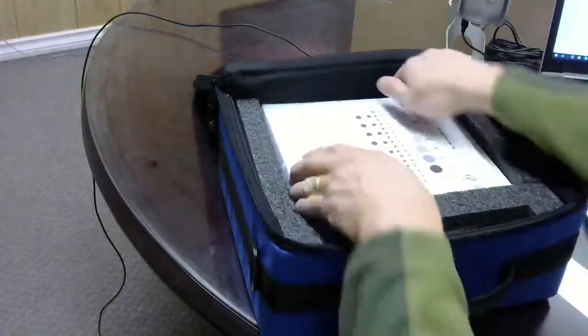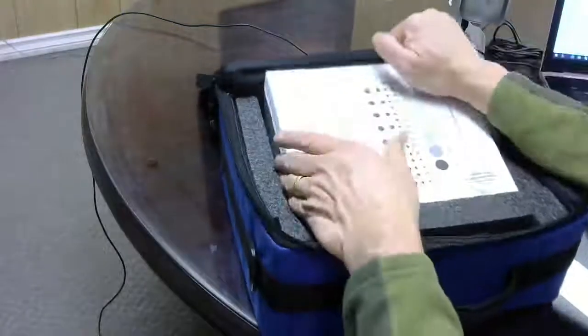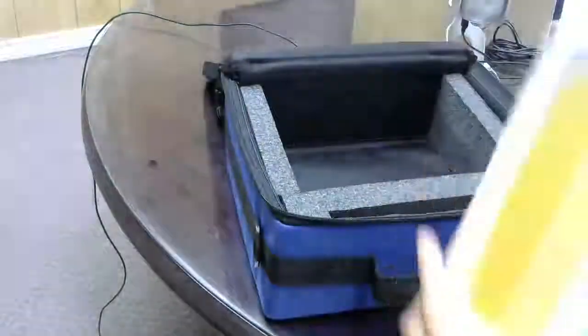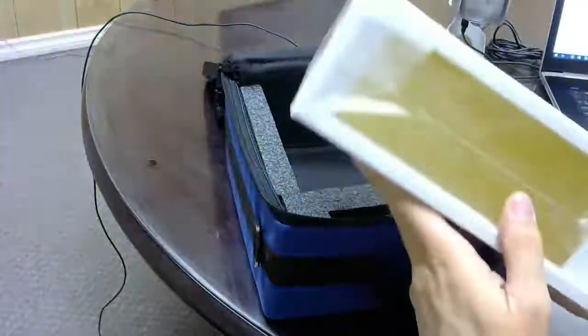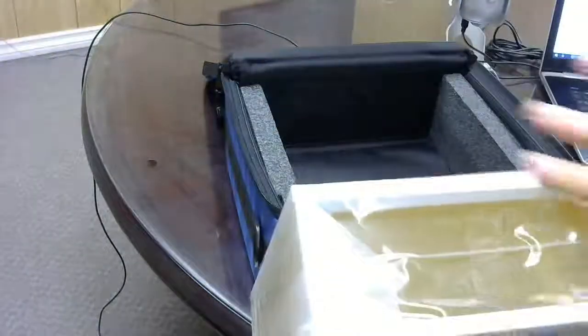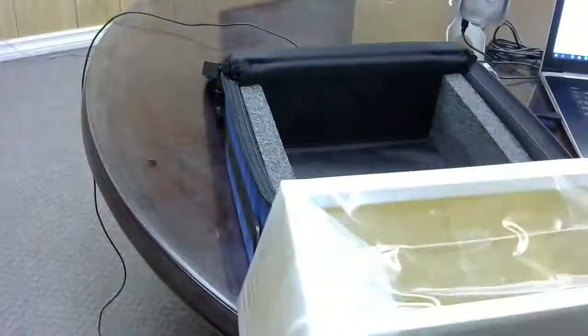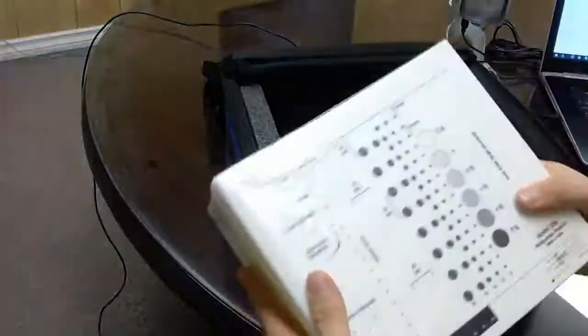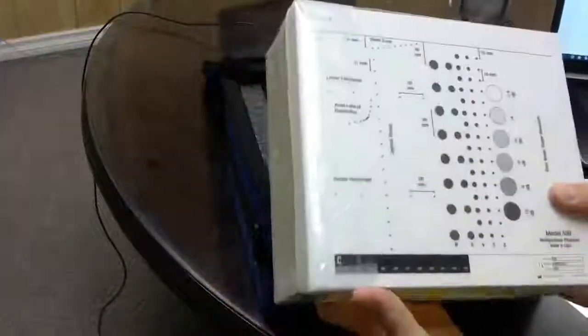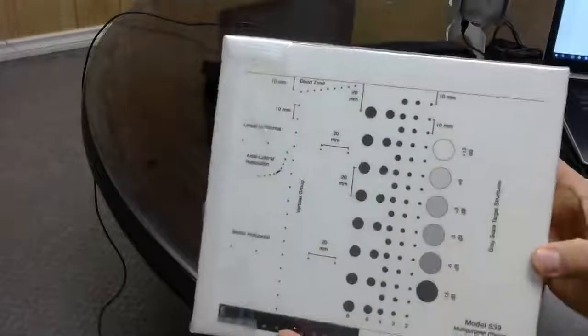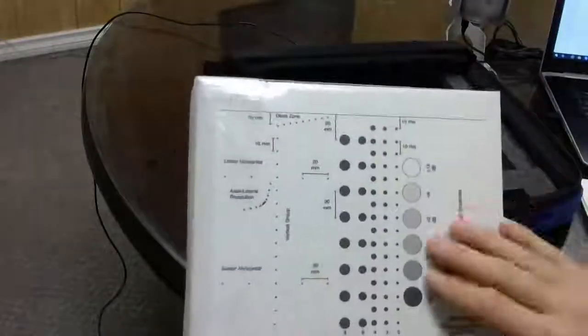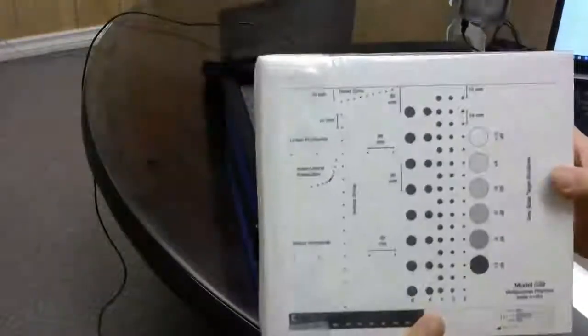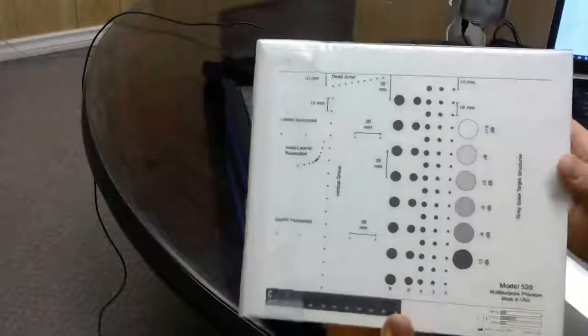So this is the phantom. It has a scanning surface on all different sides and a built-in water dam, so you can use either ultrasound gel or water. And then the actual targets—you can see where the targets are for each type of test that you want to do on the ultrasound machine.